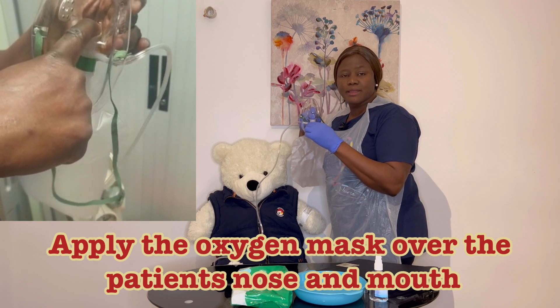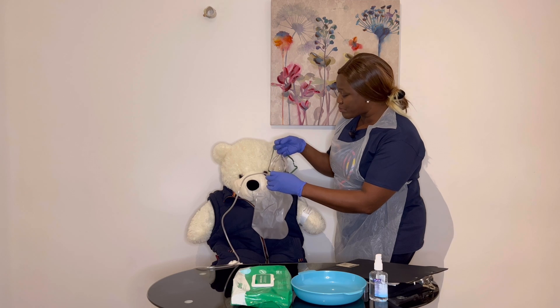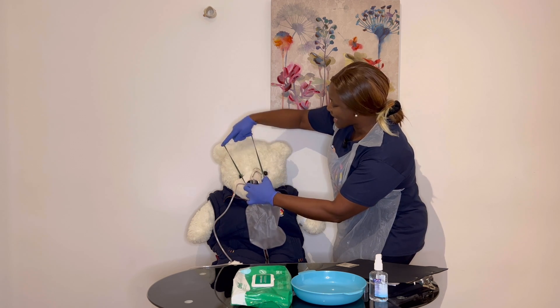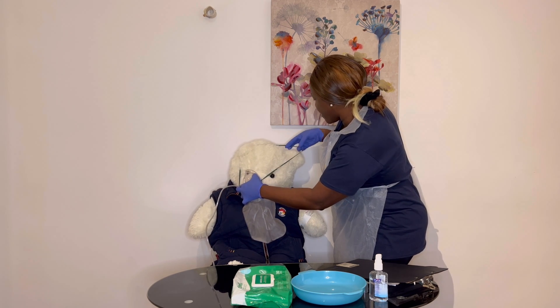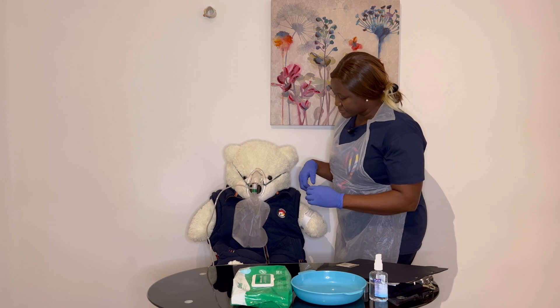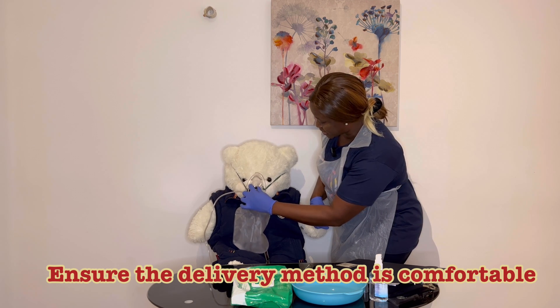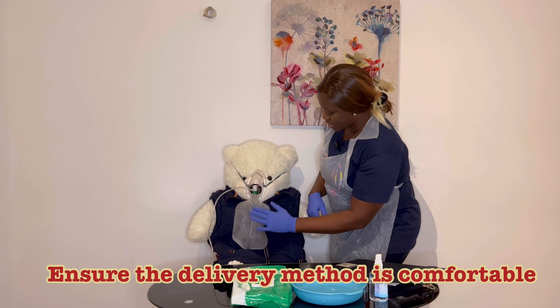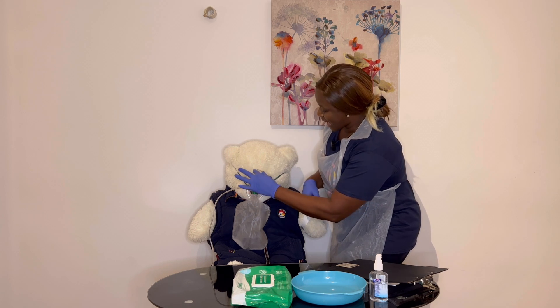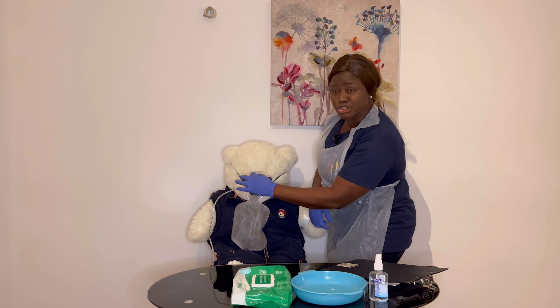I'm going to attach the mask to JJ's face. Hello JJ, I'm going to put the mask over your face — it won't harm you, is that okay? You don't need to be afraid. I pull the elastic over your head and make sure you are comfortable. I ensure the mask covers your nose and mouth so you can breathe in the oxygen — the bag is full of oxygen. I adjust the nose brace; there is a metal brace at the bridge of the nose to form a tight seal, but not too loose.